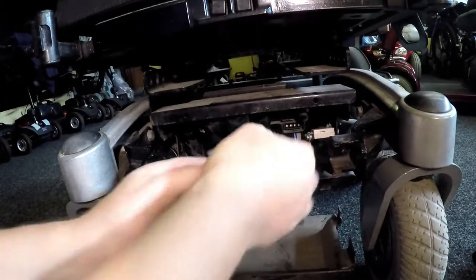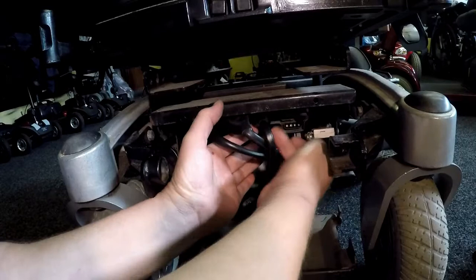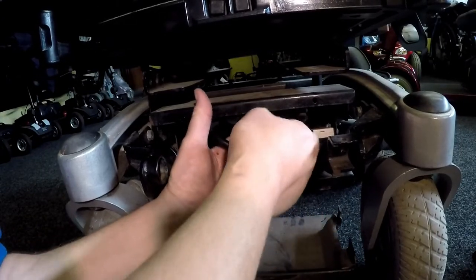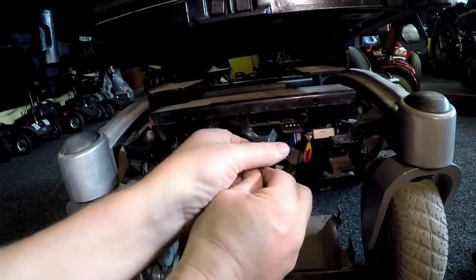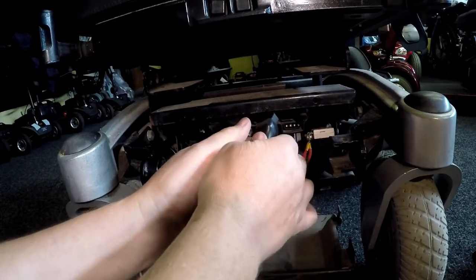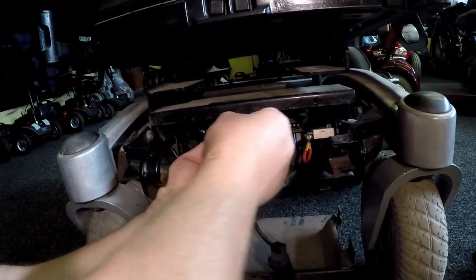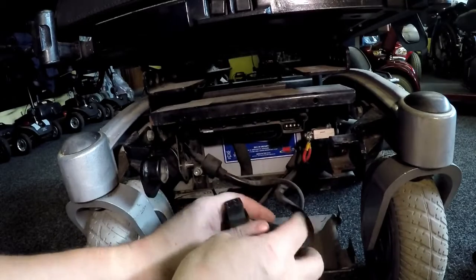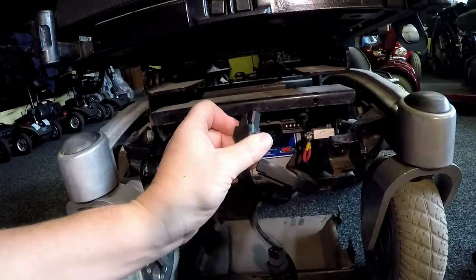So these cables have connectors underneath, so you've got to push them in and then pull it out. So I'm pushing it in with this finger, gently pulling it out because you don't want to break the retaining clip here. That's important because if you break that, you stick it in, it could constantly fall out. Same with the power module, retaining clip here, and a retaining clip here.